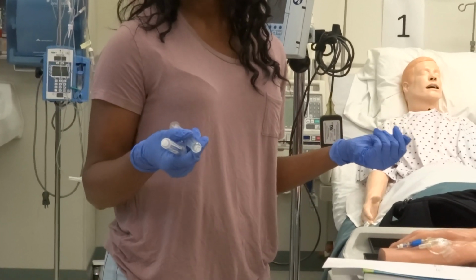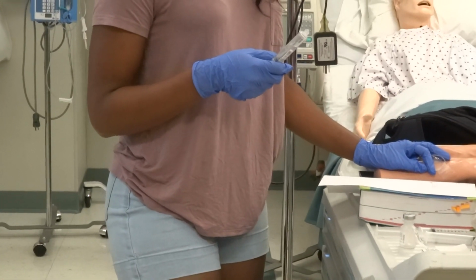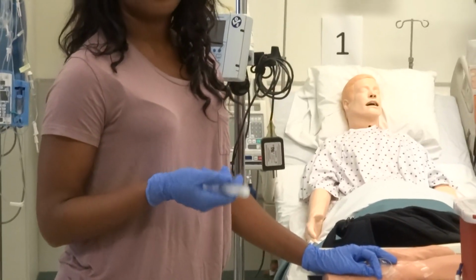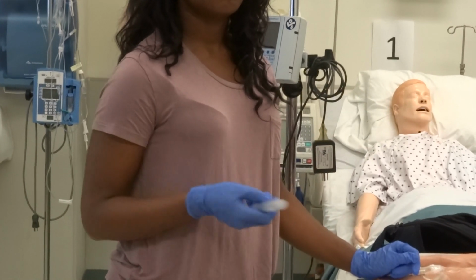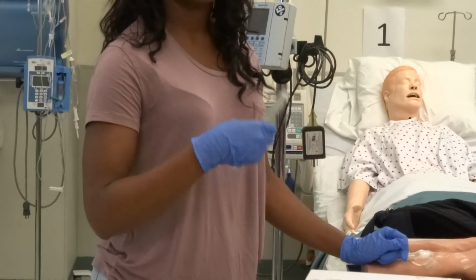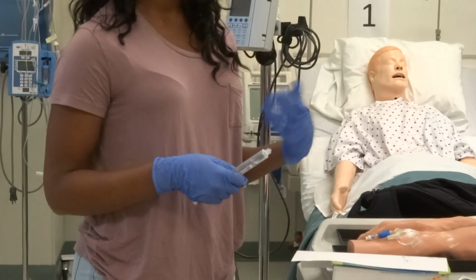Hey, say that needle part again. So do you do the whole Protonix next to the patient, or do you do it in the med room and then take it? Some nurses bring it into the patient's room empty, just to scan the bottle. Technically, all this should be done in the med room, so that when you come inside, you can just give it. But what I was saying is that you take the needle off and put it in the sharps right before you give it.